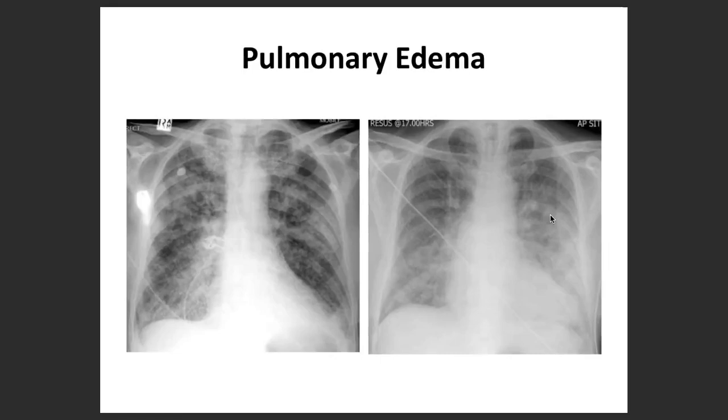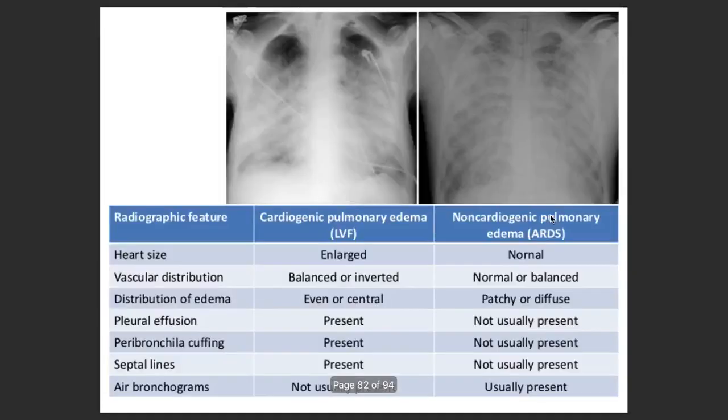And pulmonary edema, you are all now the masters, I would say. You will not be able to forget it, right? I've already shown you some examples now.